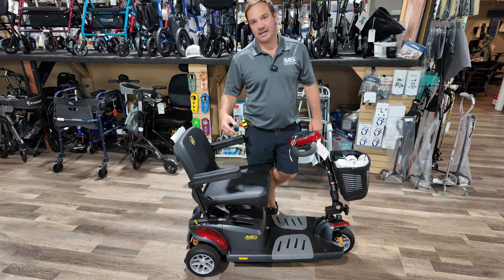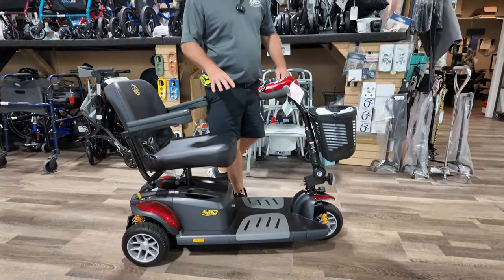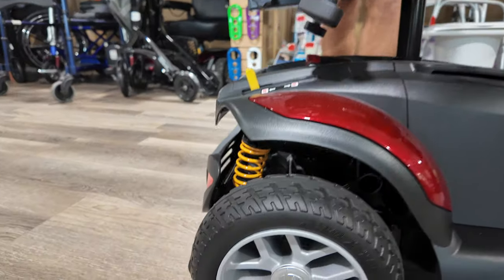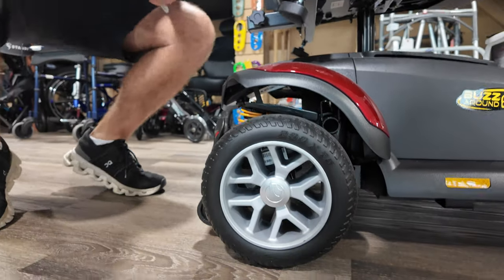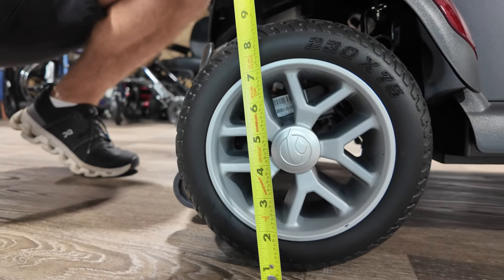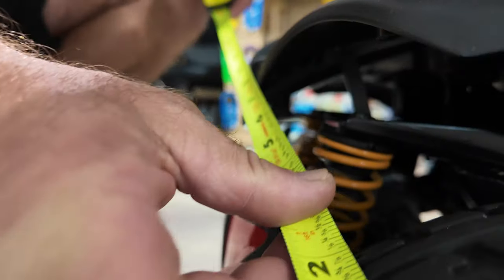I have the Golden Technologies BuzzAround EX — this is a three-wheel scooter with spring shock suspensions, kind of your SUV of scooters. It's got pretty decent-sized tires. It's not going to be an overly large scooter for primary all-the-time use in your yard, but it can go through grass and different places you might go. It's eight inches at the tire, and the tire width is about three inches across.